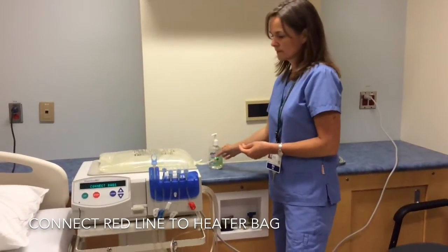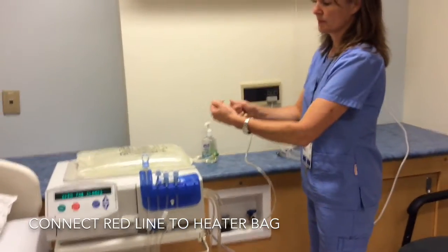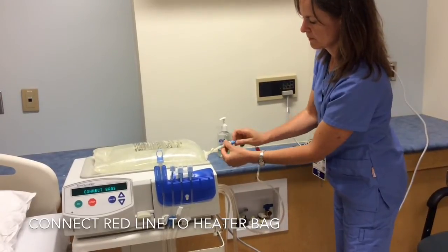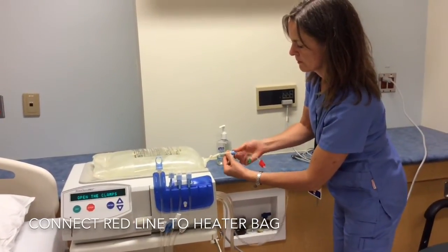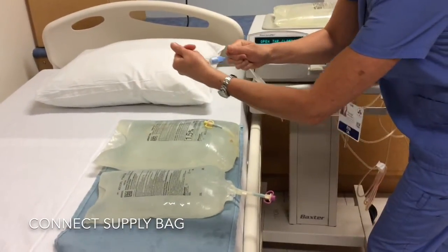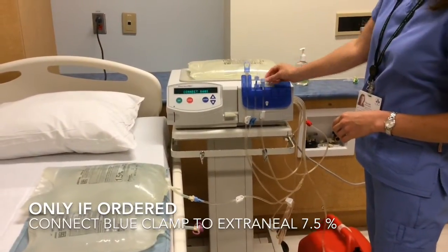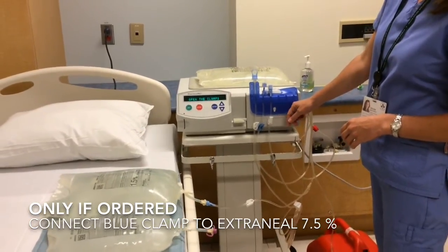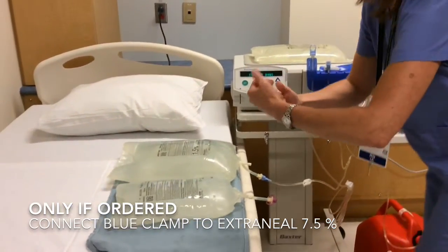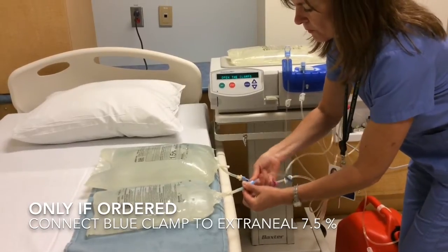After using Purell, hold the red line, pull the tab with your pinky. Hold the bag, pull the tab, and connect the two ends together — twist and turn. Now connect the supply bag to the first white line. The second white clamp is only used if the program is big enough and it's required; in this case, it's not. We're going to use the blue clamp as we're setting up an extraneal, so connect the bag. Make sure not to contaminate any of the ends. If anything touches the ends, throw everything out and start again.